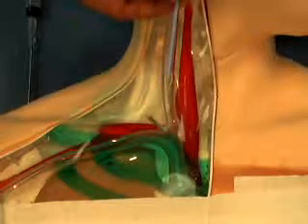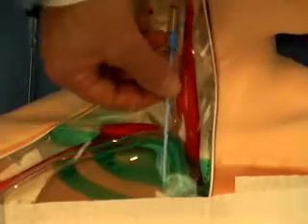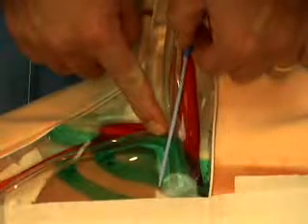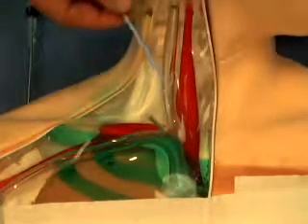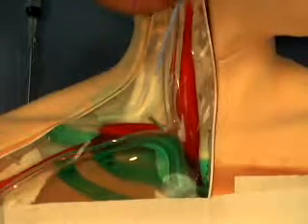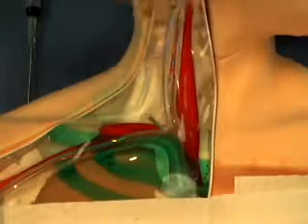The dilator is a source of a number of major vascular injuries. Most commonly, when advancing over the guide wire, the depth going in too far, such as in this example where one picks up a major vascular injury of the innominate vein. The purpose of the dilator is to actually dilate the skin only. The wall of the vein itself is actually very thin, and a catheter over a wire will easily perforate and pass through it.